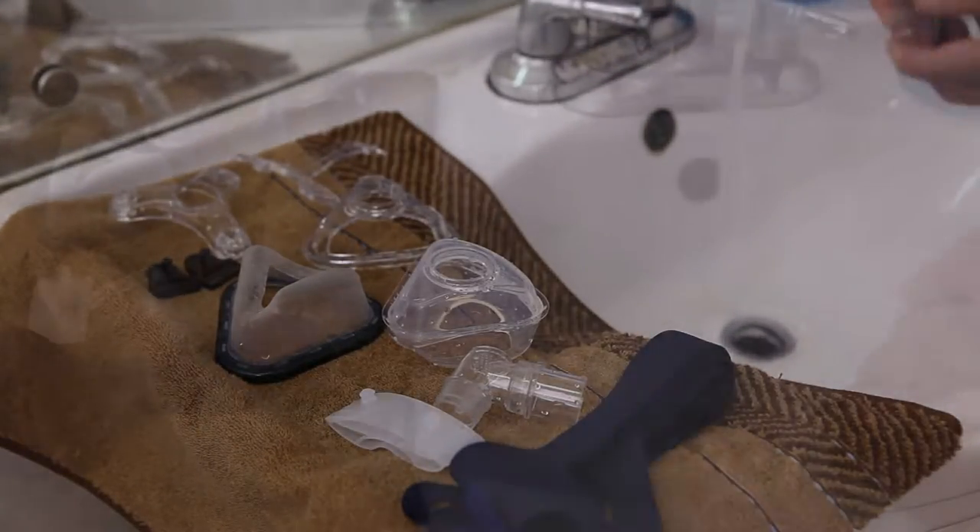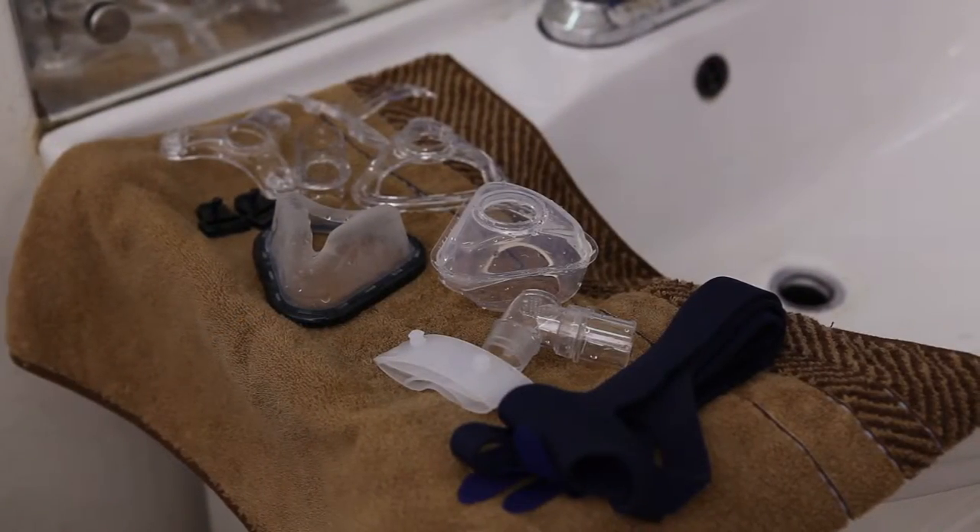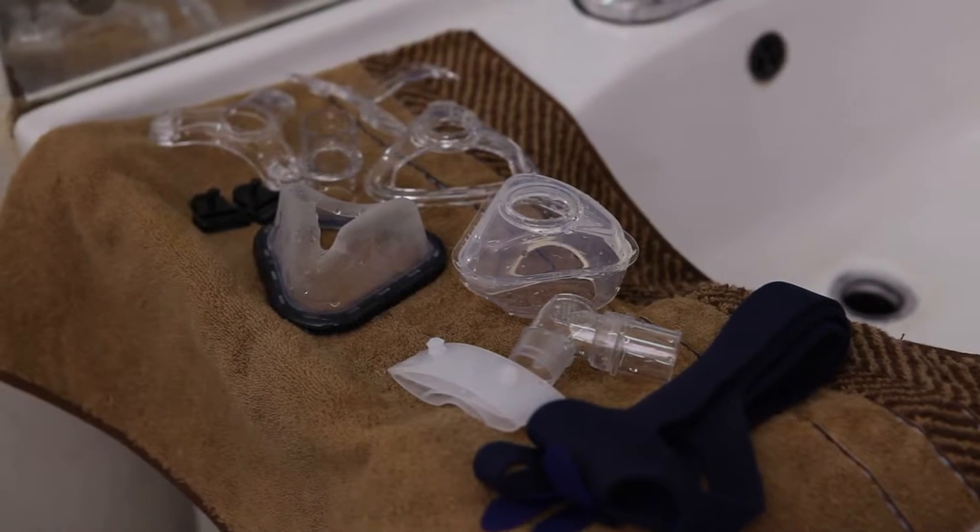Reconnect the air tubing to your device after thoroughly air drying. Please change your accessories regularly based on conditions.